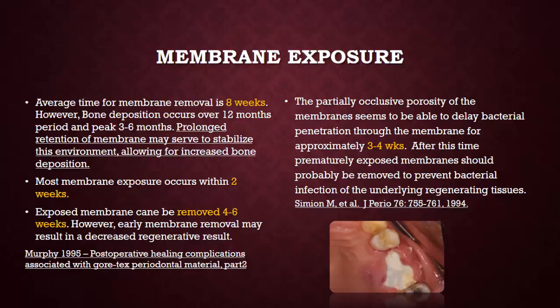لكن نحن مثل ما شايفين بالصورة هي، طالما حواف الممبرين مغطاية بالتشيو، يعني طالما ما في عندي exposure للإيدج of the membrane, we can keep this membrane as long as we can. يعني طبعا it depends on the oral hygiene, if there's an infection or not. يعني نحن إذا بنحاول نخلي المريض يكون عنده good oral hygiene، نعمل مضامد بالكلورهكسيدين ومراقب المريض بشكل دوري، ممكن نخلي membrane up to 8 weeks حقيقة ولو get exposed طالما عندي the edge is covered by the tissue.